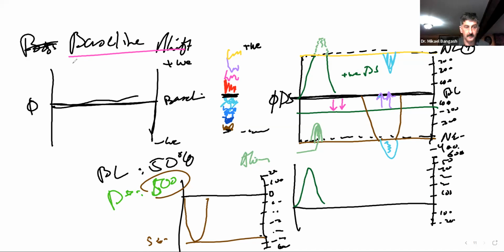The second step was that we could shift the baseline. If we move the baseline down, we just place 0 Doppler shift at a new location. From here is where you count our positive Doppler shift. Of course, it's going to increase our ability of recording higher and higher positive Doppler shifts. But that was the one that was causing us problems because it was giving us aliasing. So we got rid of aliasing by doing so.